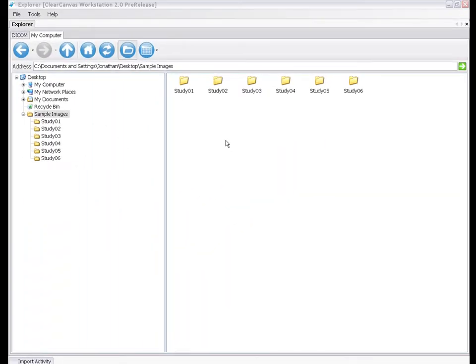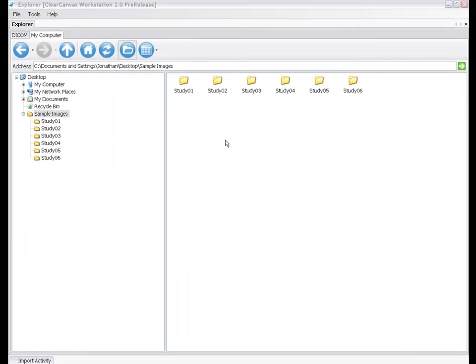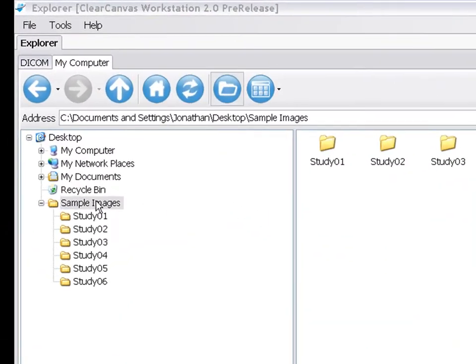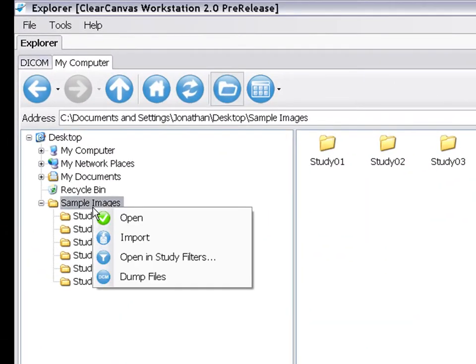To use the Study Filters feature, you can browse through a folder with your images in the My Computer tab, right-click on the folder, and select Open in Study Filters.